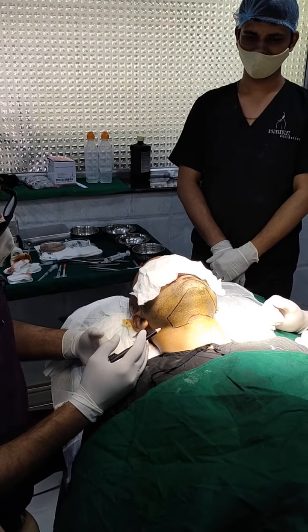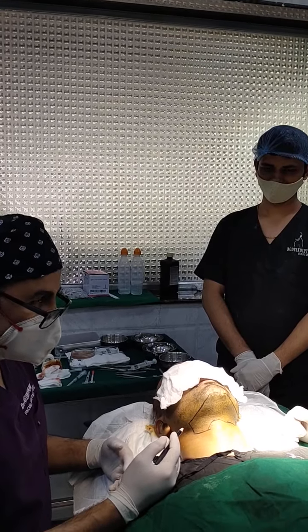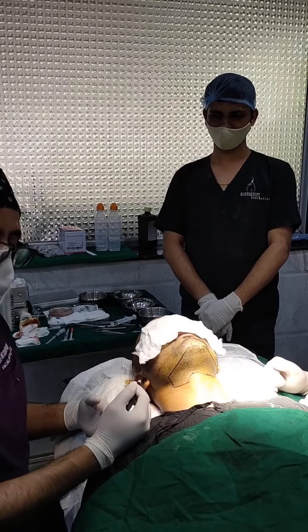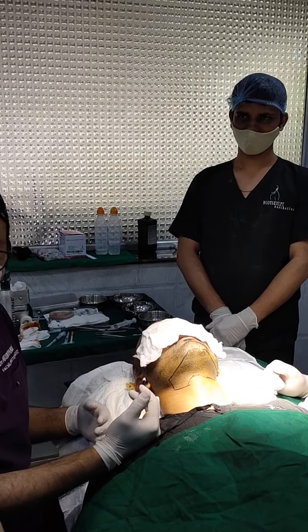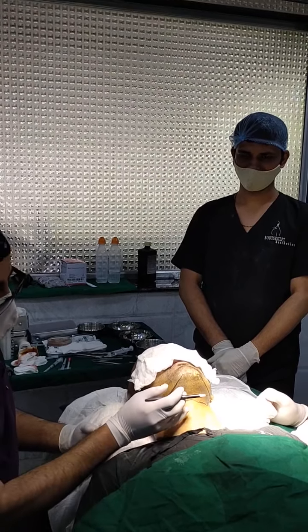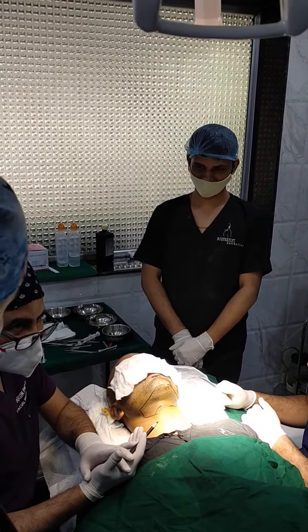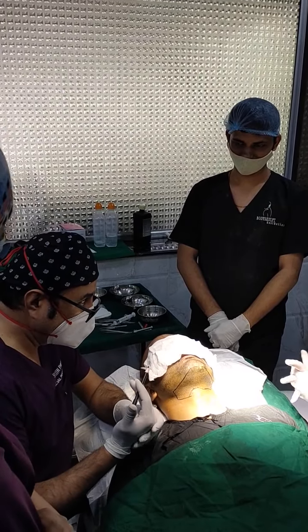This is going to be our area from where we will be taking the grafts. If a patient has a good amount of donor beard, we are looking at about 700 to 800 grafts from here, and if not, maybe 300, 400. So what's the advantage of taking beard? If you take beard and combine it, we get increased density of the hair. This is not an ideal situation for making the hairline because the texture will never match, but it gives a very good density when you mix it with your normal occipital hair area.